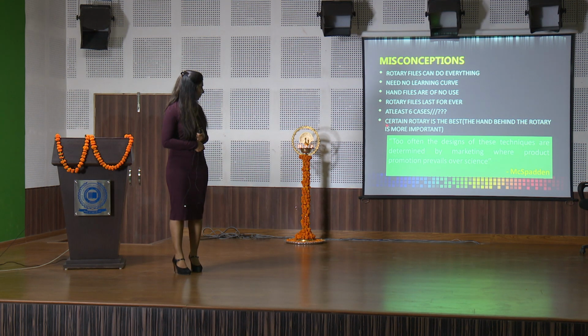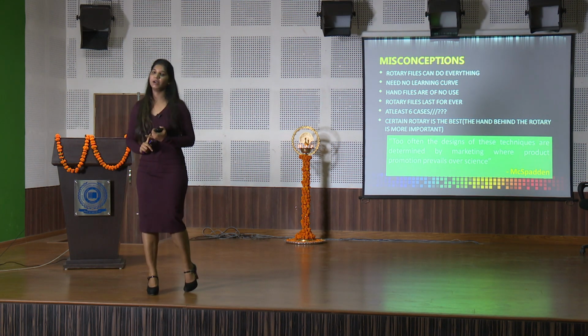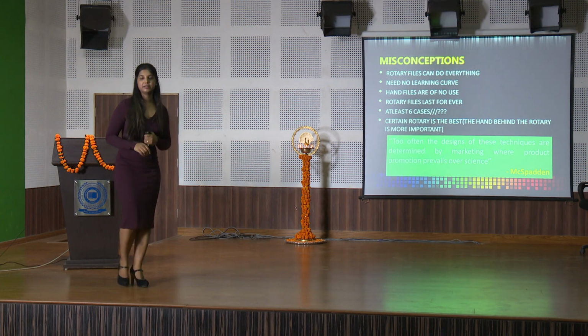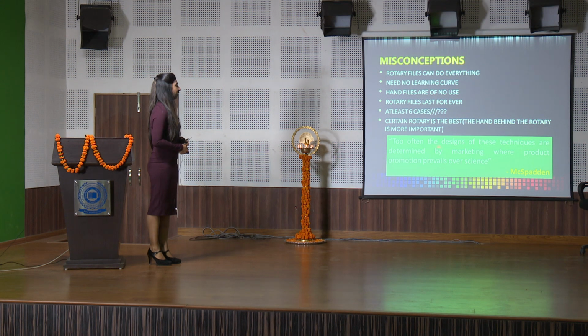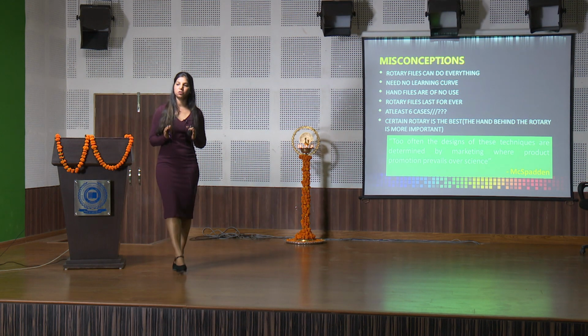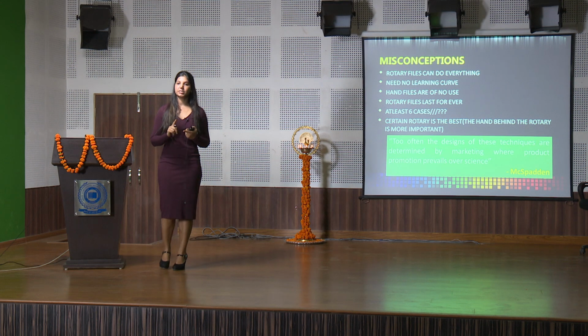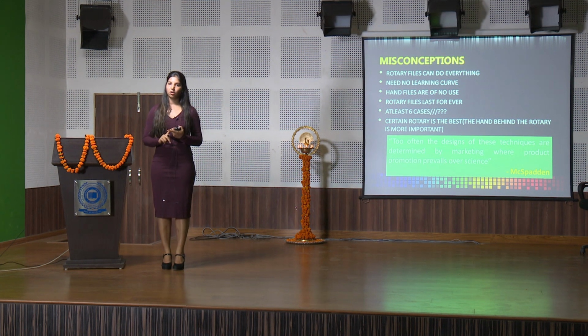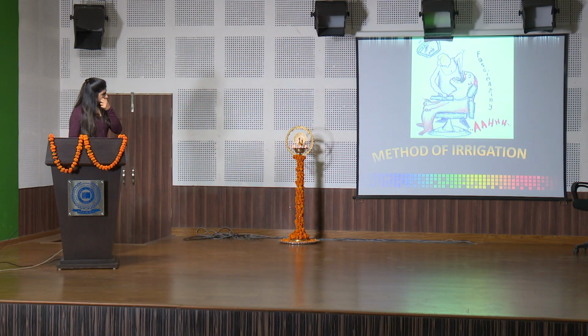Last and the most important myth is that a certain rotary is the best. How you use the rotary, how good you are as a clinician is more important than which system you are using. So too often the designs of these techniques are determined by marketing, where product promotion prevails over science. So today we are going to talk about science and not the product promotion. And then you have to decide for yourself which technology is better and which technology when combined with biology will yield us better results. What's important is the sequence and method of irrigation.